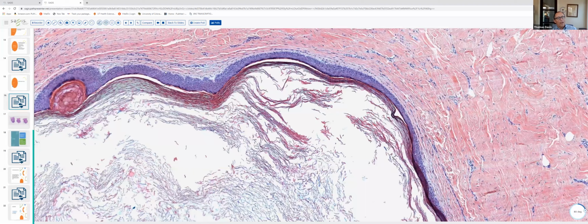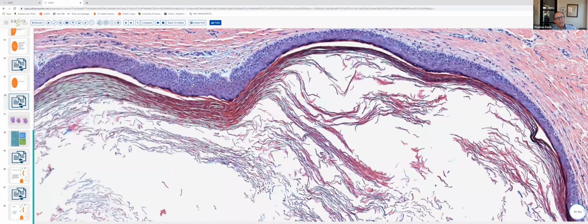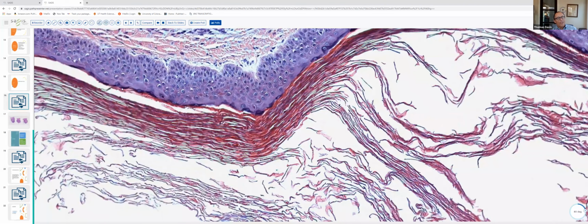As a result, they're lined by stratified squamous epithelium. There's interposition of a granular layer, and the keratin in the center of the cyst is this nice basket weave keratin. And you might say, well, this looks just like the epidermis, and you're right.